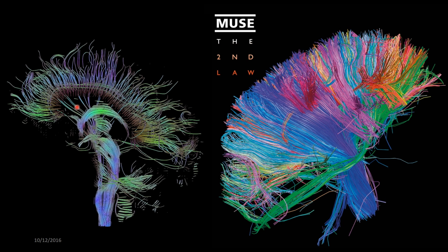So you can see here that this would represent your various lobes, and then the fibers that come down and connect them. And it's the same on this one, although obviously if you're not familiar with this kind of imaging, you're not going to be able to see it. But that's just an overall thing of MRI. We do lots and lots of other things with MRI as well. That's just an overview. I can't really tell you much more, but we are going to move on to ultrasound next.